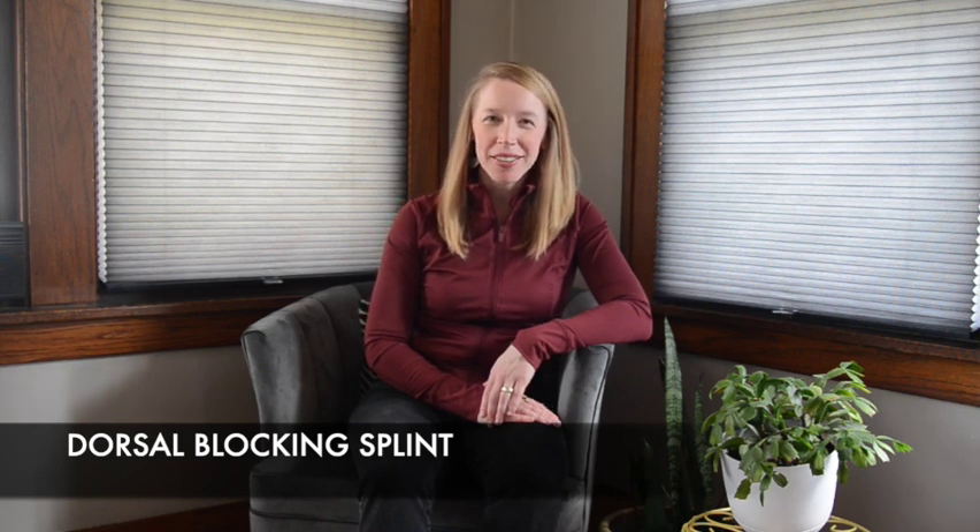Hello, my name is Vanessa. Welcome to OrthoRefresh. This video will review how to place a dorsal blocking hand splint. This is important when there is a laceration in the palm or volar finger and there's concern for a flexor tendon injury.